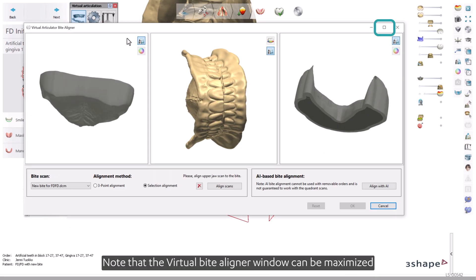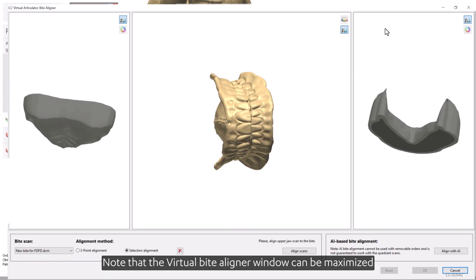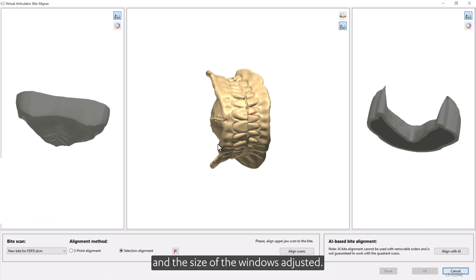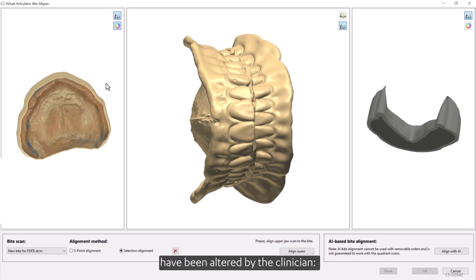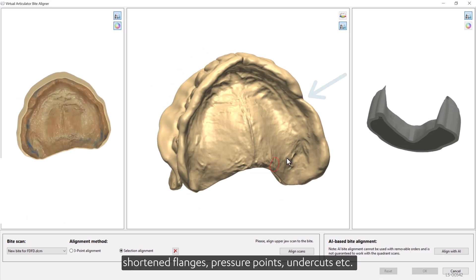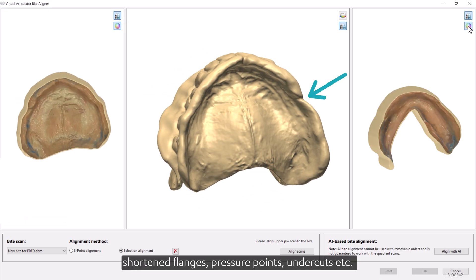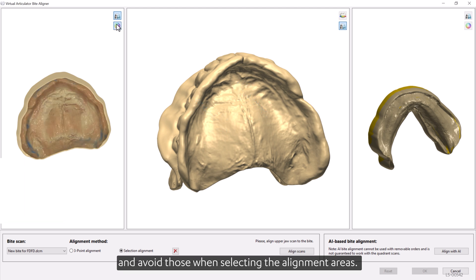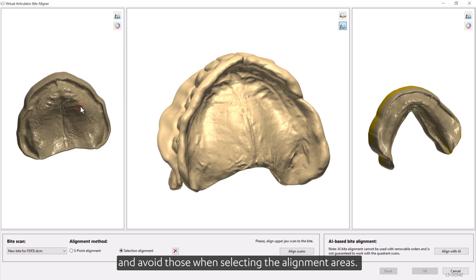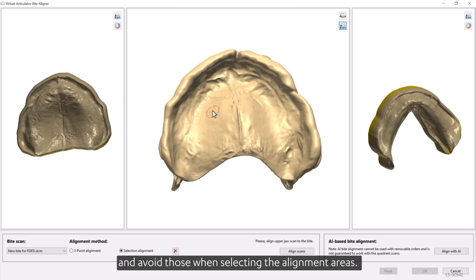Note that the Virtual Bite Aligner window can be maximized and the size of the windows adjusted. Make sure to keep track of which areas on the try-in dentures have been altered by the clinician — shortened flanges, pressure points, undercuts, etc. — and avoid those when selecting the alignment areas.